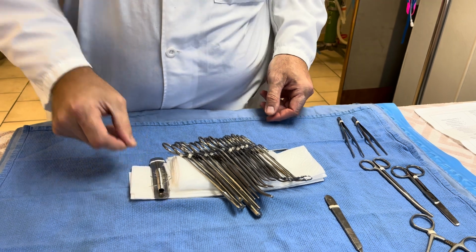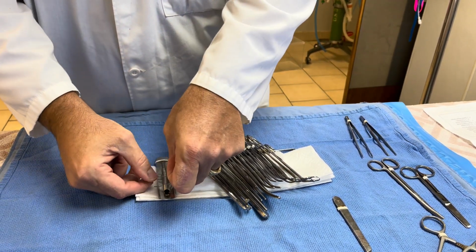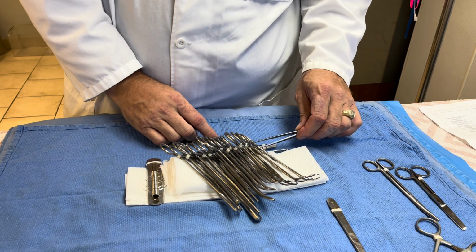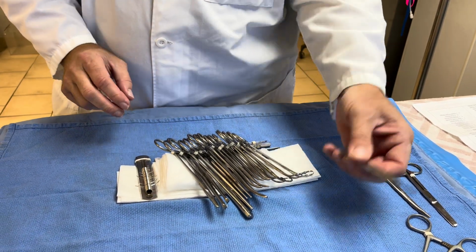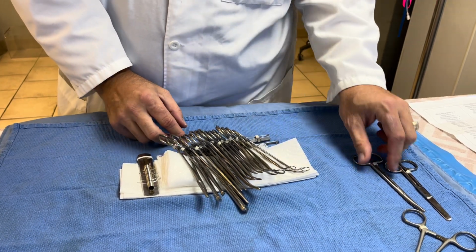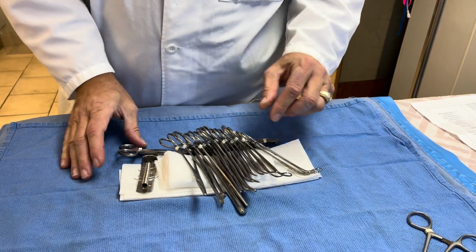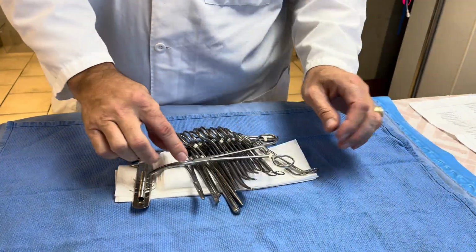Our needle holder, although we do still put these in our packs even though we don't use them very often, just in case. And then you can pop your 2 forceps also through there if you want, or just slide them underneath. Your scalpel handle slides underneath, and the scissors also go underneath. We'll put that until the end. And then this guy can go right on top.